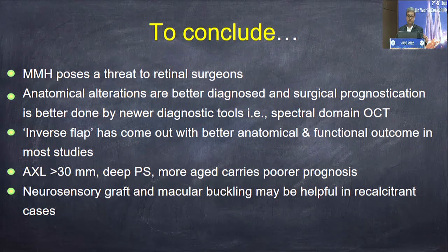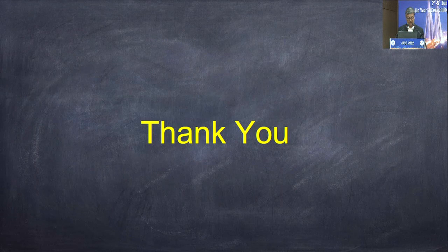So to conclude, it is a very difficult scenario for any VR surgeon. Inverted flap, if you are going inside, gives you better results. If the axial length is more than 30, with a deep seated posterior pole, posterior staphyloma, it gives you a poor prognostic outcome. Even if you close the hole or settle the retina, the visual outcome is very bad. Thank you.